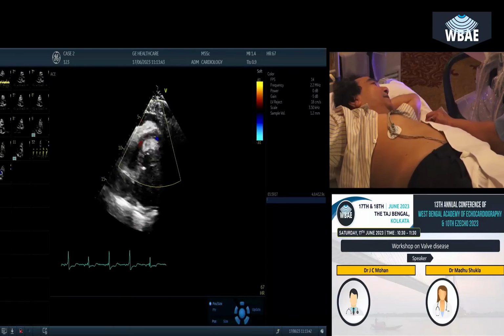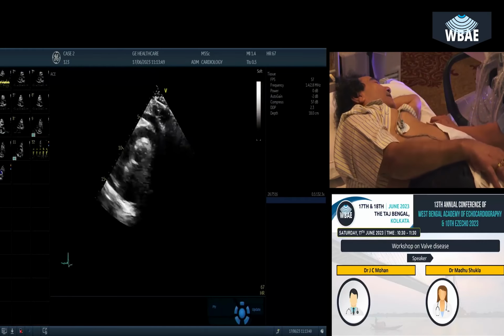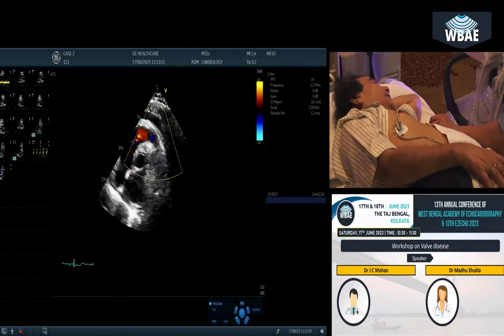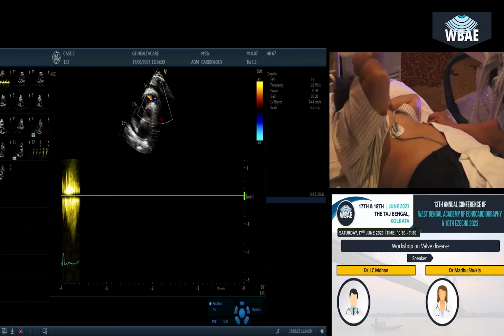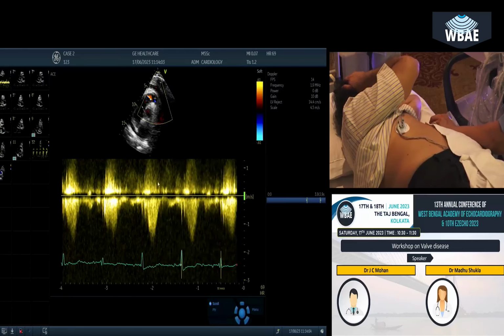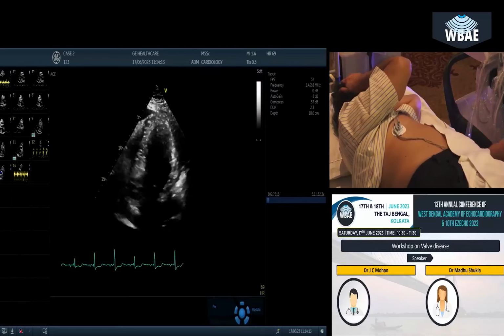You can see some turbulence there. Definite obstruction is there. No, but you have too much of reject. Yeah, the patient is moving. Yeah, there is some gradient. Just so we know that we are not in the line of fire. But it's okay. We know that there is a gradient of up to 2 meters per second velocity. So that's the reason I think the PAT was not coming. Yeah, that's true. You are not getting that, but okay, now we'll go to apical.